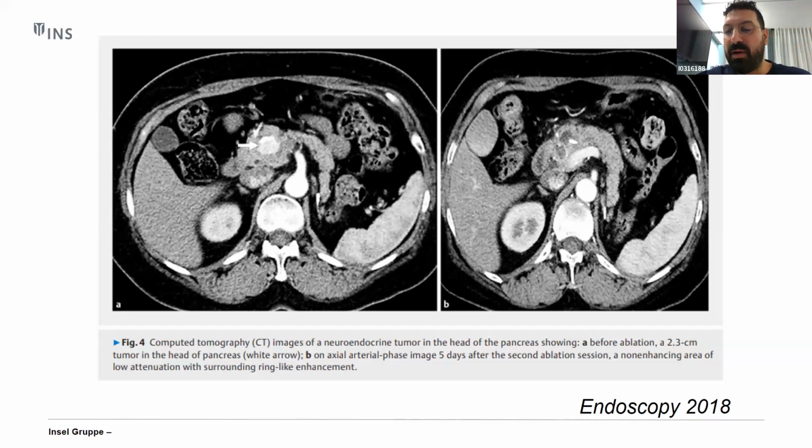Statistisch macht es meiner Meinung nach nicht unbedingt Sinn. Wir waren vor Ort bei Barthet in Marseille, und er hat uns gesagt, dass er es am Anfang gemacht hat, also prophylaktisches Stenting sogar, aber danach in den weiteren Serien, als seine Expertise zugenommen hat, hat er das nicht mehr gemacht. Für ihn bleibt es ein sicheres Verfahren, und das hat alles auch mit zunehmender Expertise zu tun.